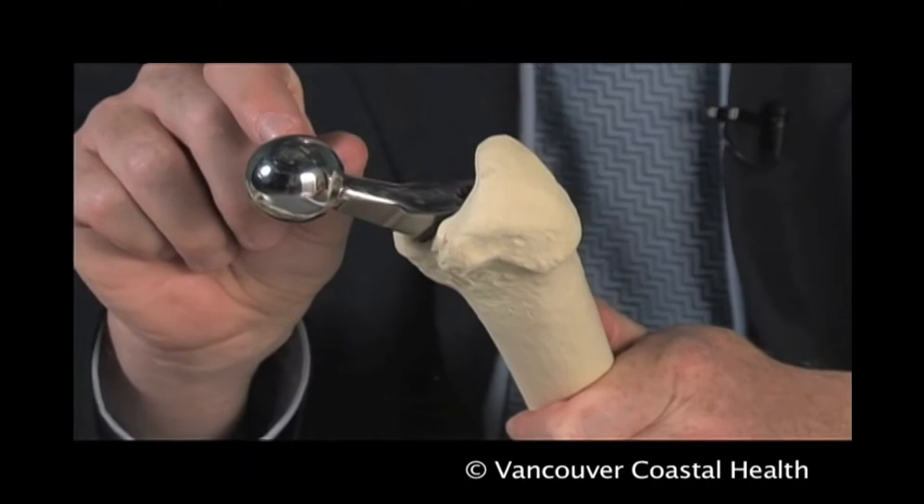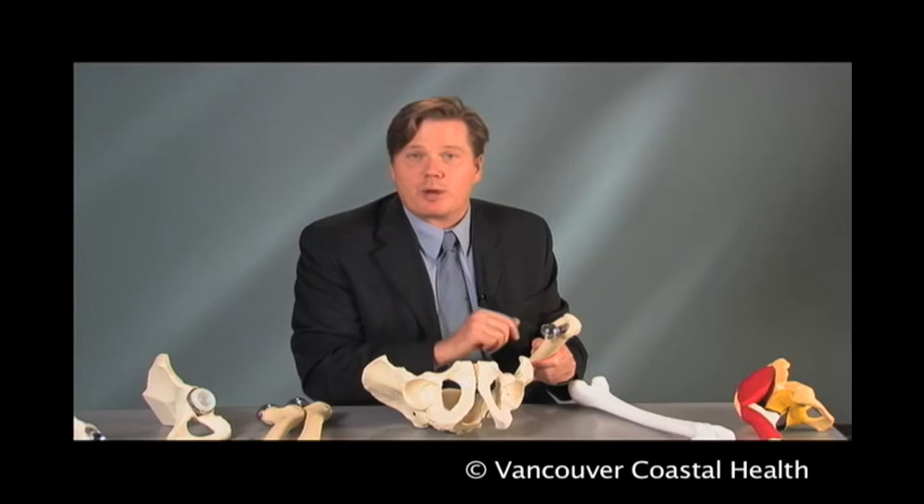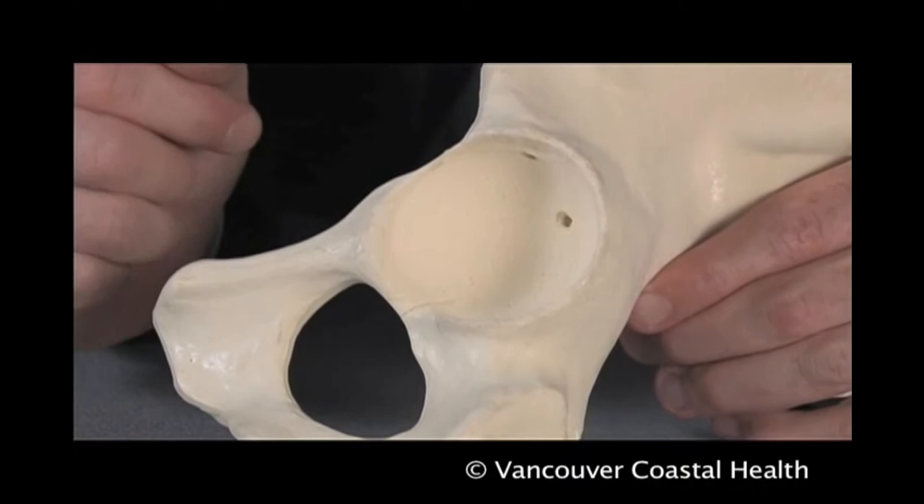On top of that implant, a number of different ball sizes and neck sizes can be placed to reproduce the normal anatomy of the patient. The reconstruction will be solid and can be associated with full weight-bearing and good resumption of leisure activities.